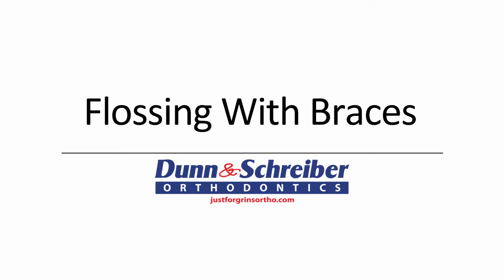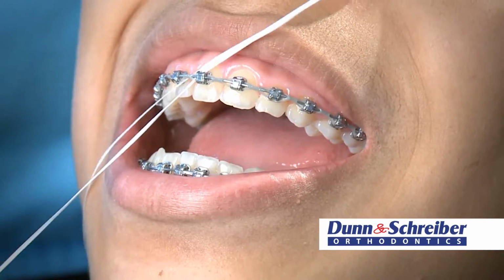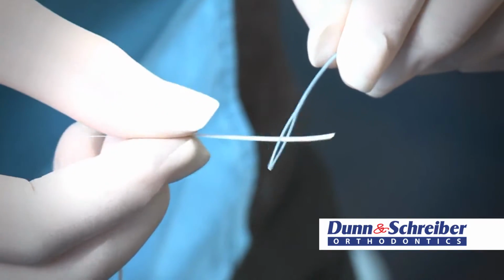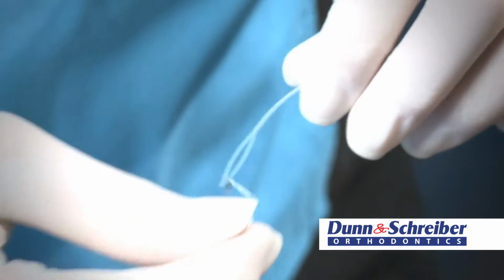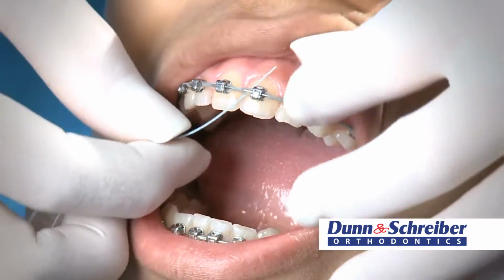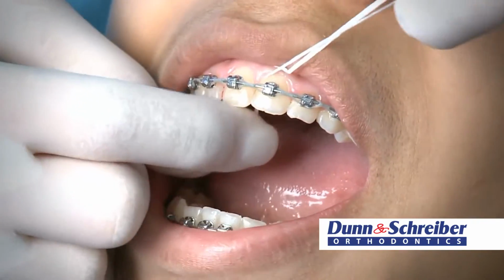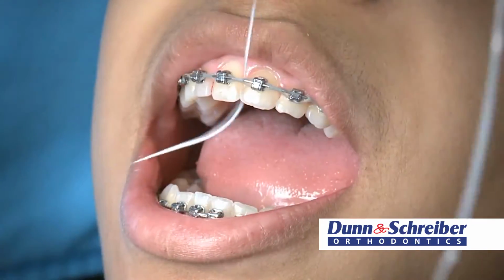Okay, let's go over how to floss with your braces. You're actually going to need to thread the floss under the arch wire. So to help you do that, you can use what's called a floss threader. Start with about 18 inches of floss and pull 3 to 5 inches of the floss through the loop at the end of the threader. Now thread the floss threader under the arch wire and gently go between your teeth, hugging the sides of each tooth. Then just remove the floss and keep going around in between every tooth.